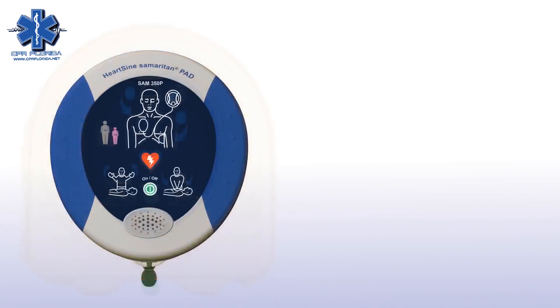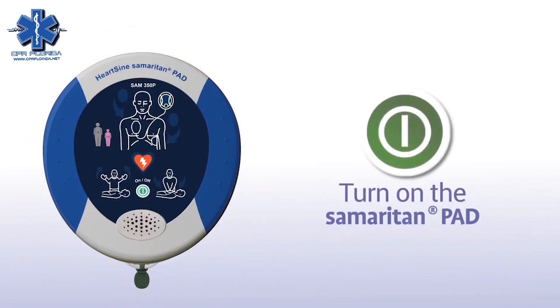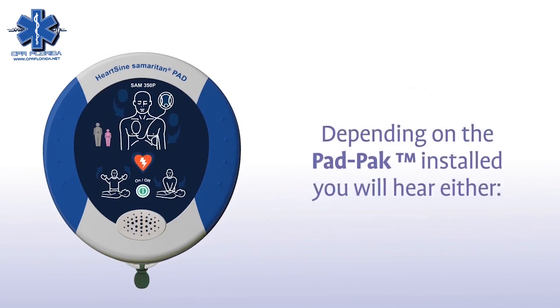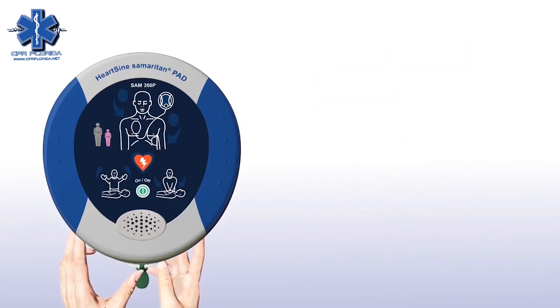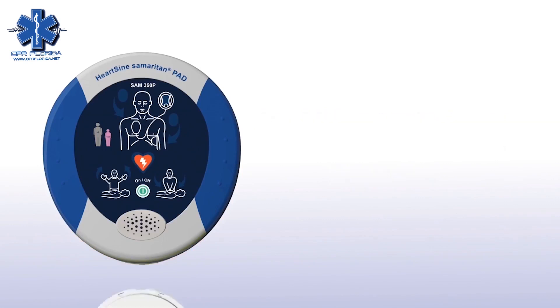Press the green on/off button to turn on the Samaritan PAD. Depending on the pad pack currently installed, you will hear either an adult patient or a child patient prompt. If the patient is a child between one and eight years of age, you should ensure a pink pediatric pack is installed. If a pink pediatric pack is not available, you may use the gray adult pad pack instead.